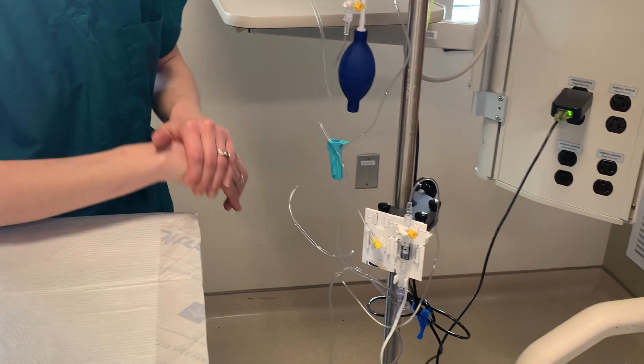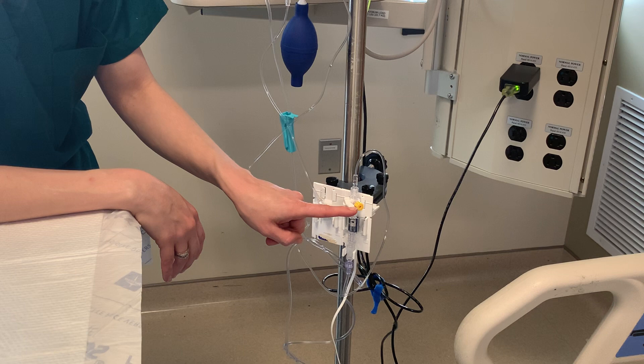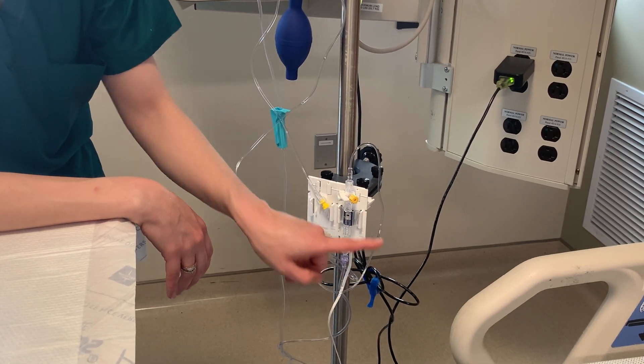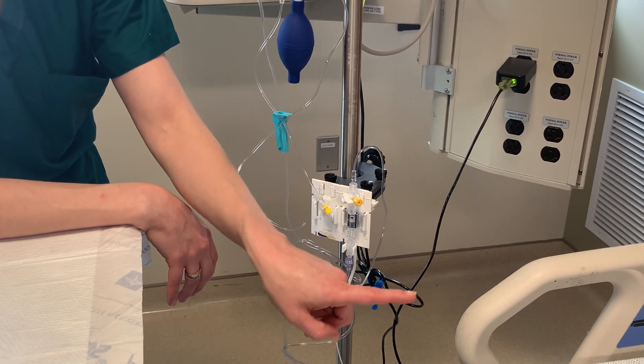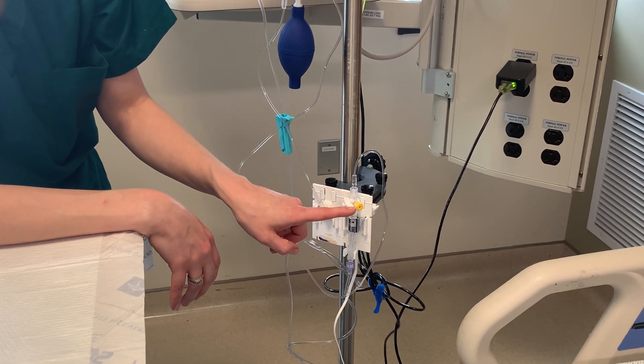And where is that leveled on the patient? This port right here will be leveled at the patient's heart, or the phlebostatic axis. The phlebostatic axis will be at the mid-axillary line in the fourth intercostal space.